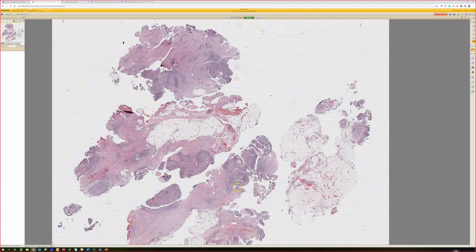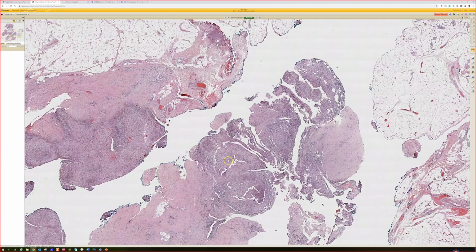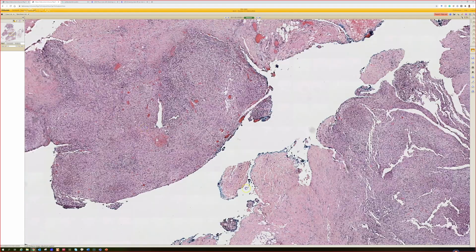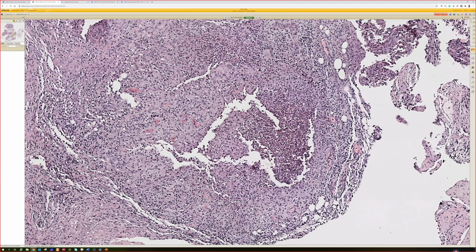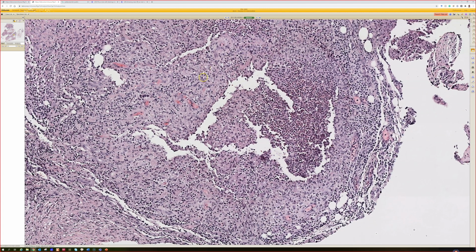No worries. So this is another deep sample here. Yeah. And you can already see from scan that there's a lot going on in terms of inflammation. Which was pretty nonspecific at first until I found there was one particular area where I found a nice little granuloma surrounding a bunch of neutrophils. Probably right here once it comes in focus. This is a pretty good one. Here's a rim of epithelioid histiocytes making a big round granuloma, and in the middle, neutrophils, right?